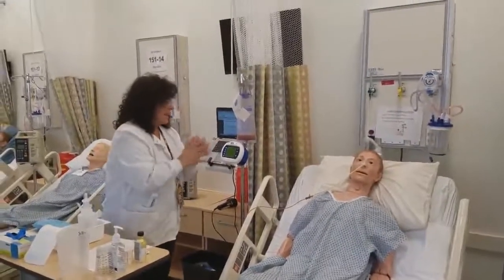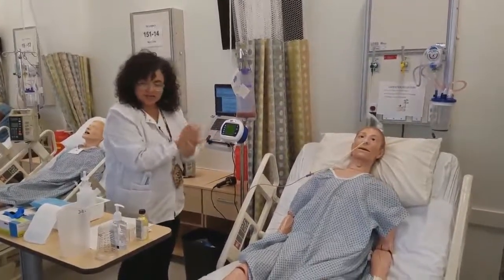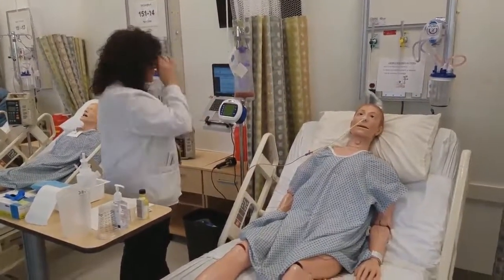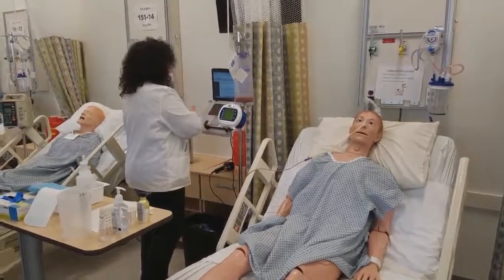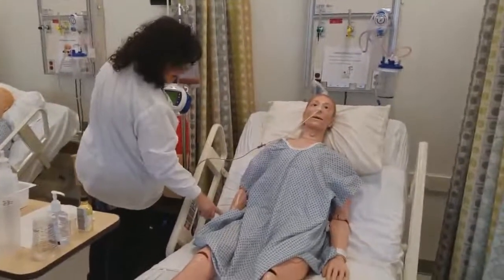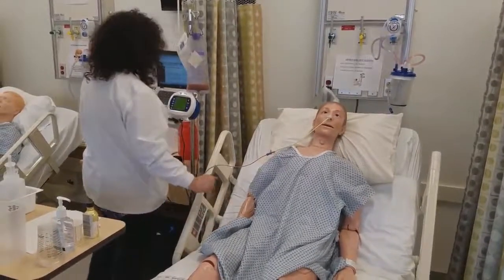I'm washing my hands. Hello, Mr. Blue Devil. I have some medicines for you this morning. And I also have to check out your tube and your tube feeding, make sure everything's going well in that regard. First things first, can you please state your name and date of birth for me? And he says his name and date of birth. I pull up the chart. I check to make sure that this is indeed Mr. Blue Devil. Everything matches up.